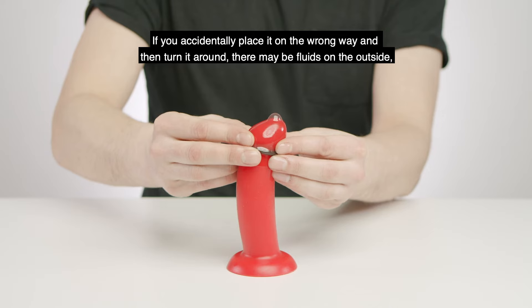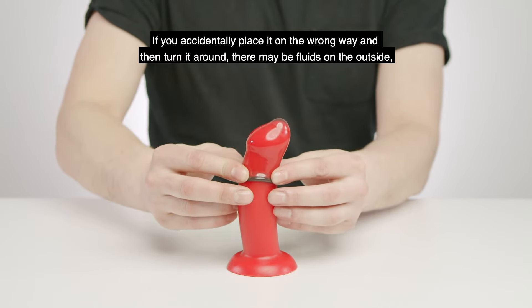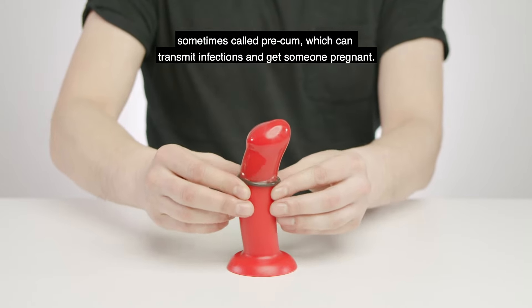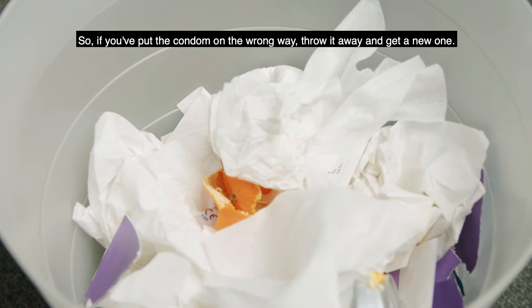If you accidentally place it on the wrong way and then turn it around, there may be fluids on the outside — sometimes called pre-cum — which can transmit infections and get someone pregnant. So if you put the condom on the wrong way, throw it away and get a new one.